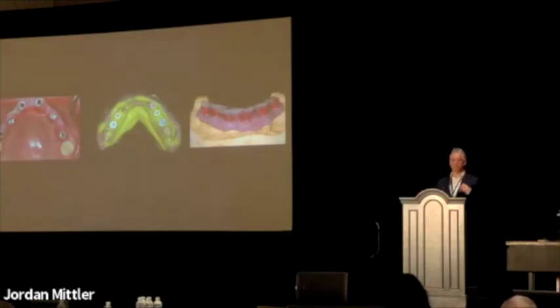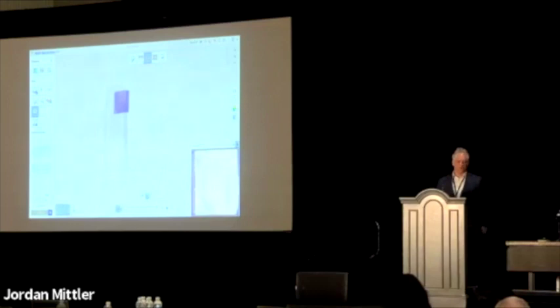So for me, photogrammetry solves this problem because, number one, I don't have to depend on people for that precious data. And I know that when I fabricate something on this implant position that photogrammetry has given me, I can count on it 100%. And the beauty is I've trained hundreds of assistants across the country on how to do it, right? So it's very simple. The problem is still cost effective. It's cost prohibitive.